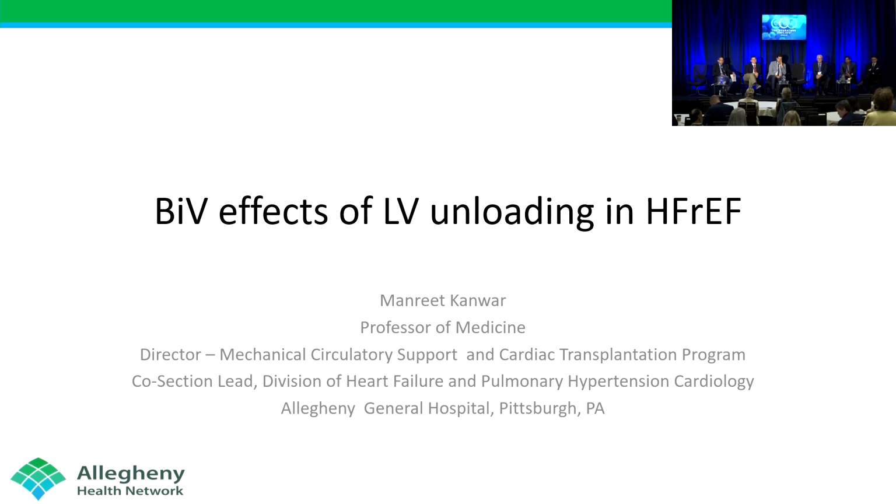Second point I wanted to make about Manreet's cases. We all know that in LVAD, there are two potential mechanisms of right ventricular dysfunction. First, a permanent LVAD disturbs the geometry of the right ventricle because it changes the motion of the septum. Second, it increases the workload on the right ventricle.